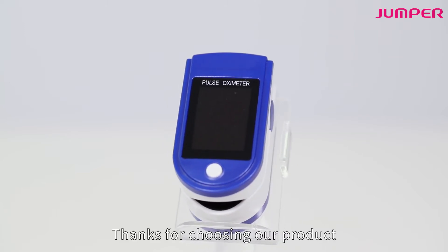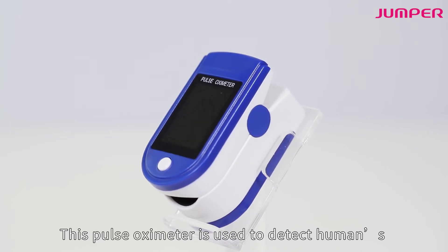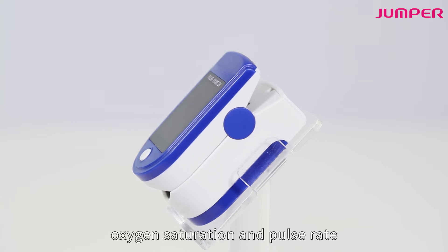Thanks for choosing our product. This pulse oximeter is used to detect human's oxygen saturation and pulse rate.